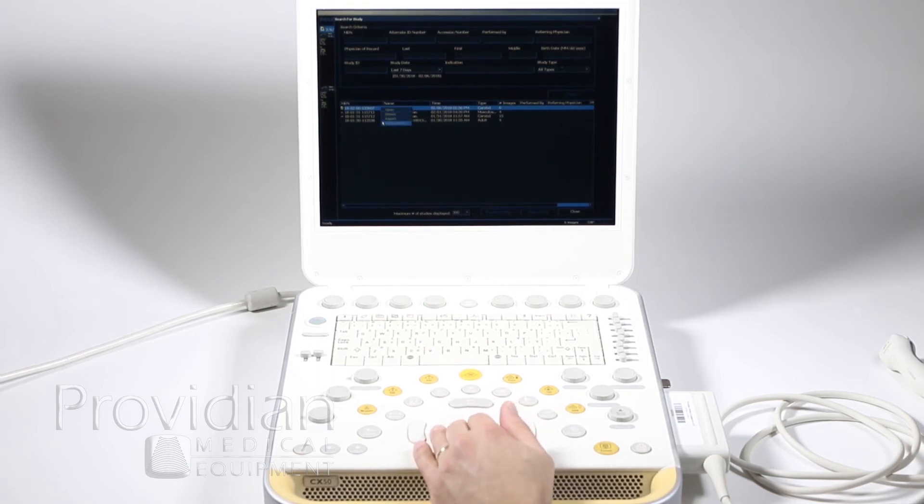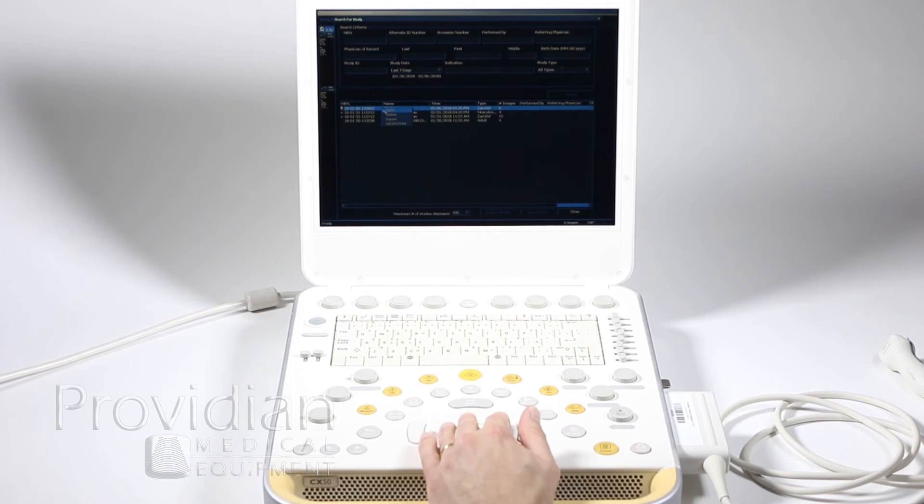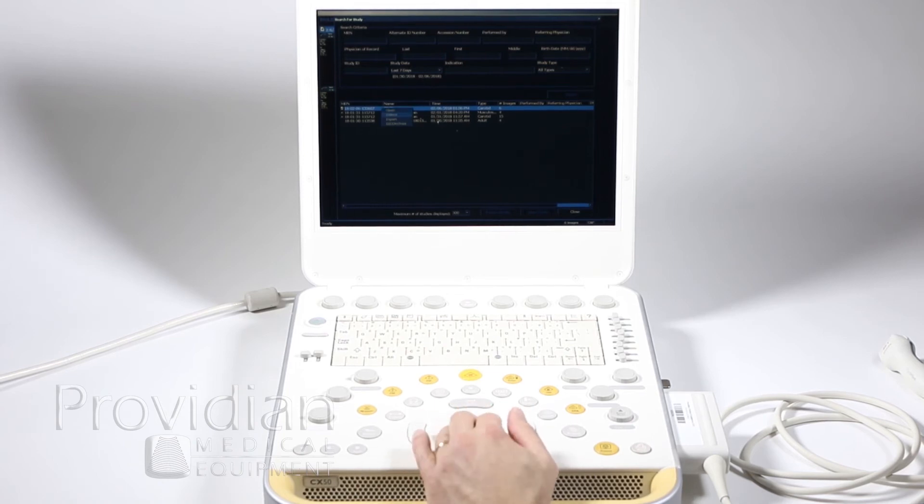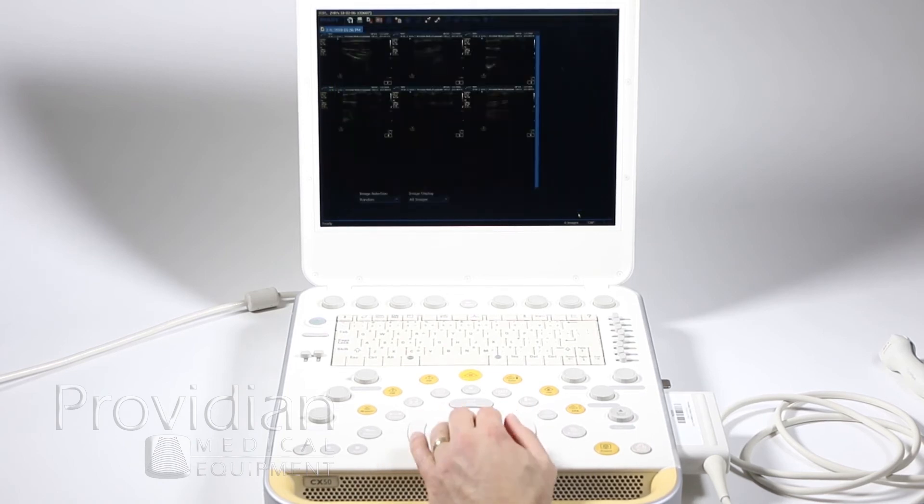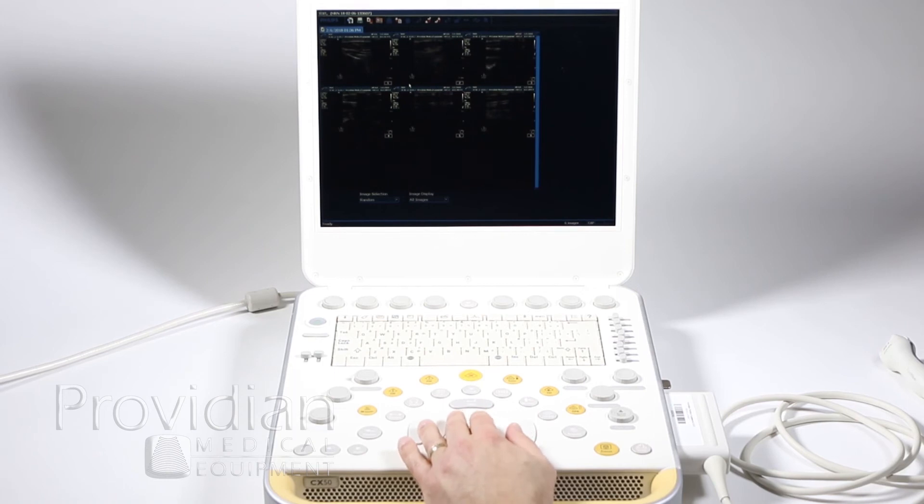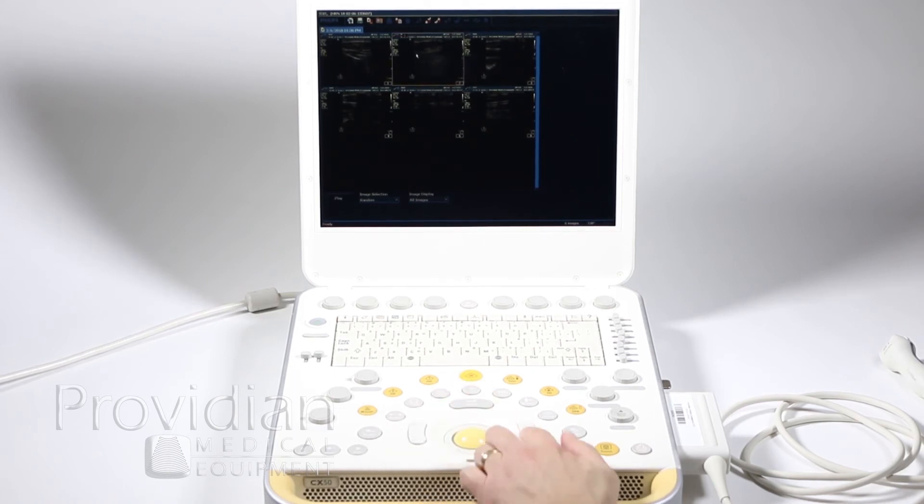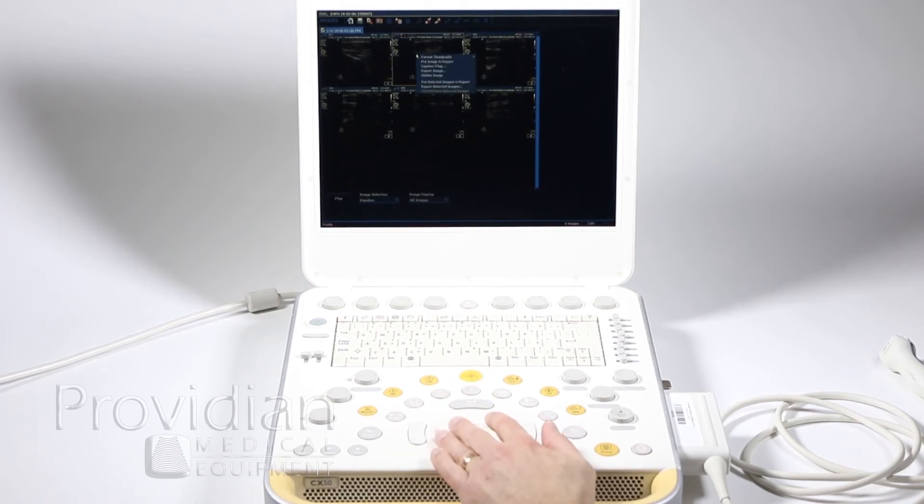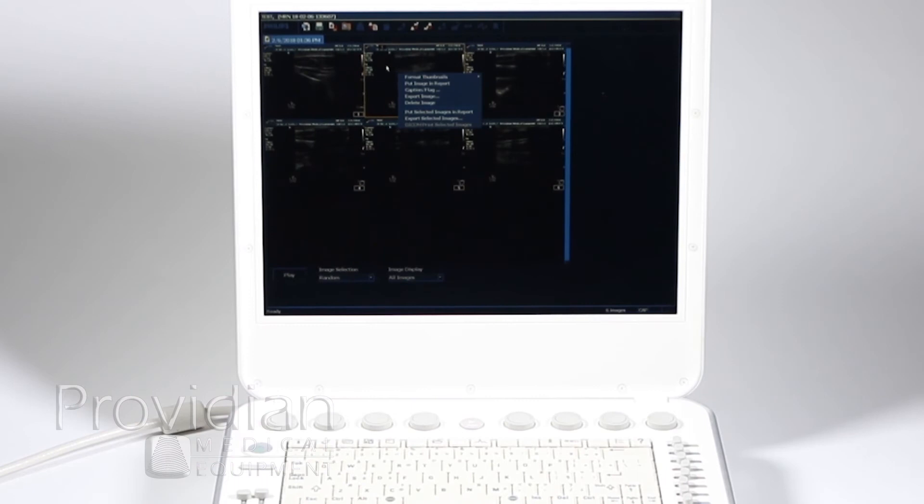So I can open that up, delete, export, DICOM, print. Since it's already open, it's not going to let me do anything. I can just hit Close and it's the active patient, so it's not going to let me select that. So here I can do the same. I can right-click on these and get a whole lot more options.